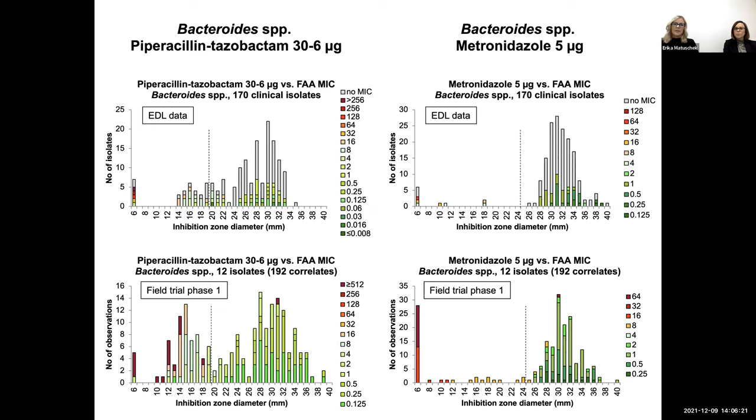So I think one of the most important things right now is to start practicing with the Clostridium perfringens anaerobicity test strain with the QC strains, and also to contact your suppliers of plates if you do not make your own plates, and start asking them for FAA plates for AST, not FAA plates for culturing anaerobic bacteria, because you don't want those plates. They are not necessarily correct in agar depth or in content. So you need to make sure that they can produce plates for AST for you. And you might as well start asking now, because it may take some time before your local supplier will be able to supply you with these plates.